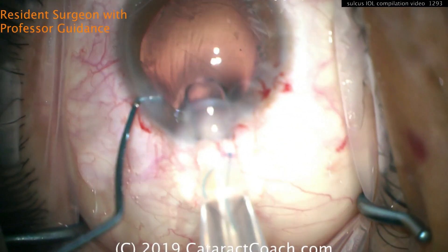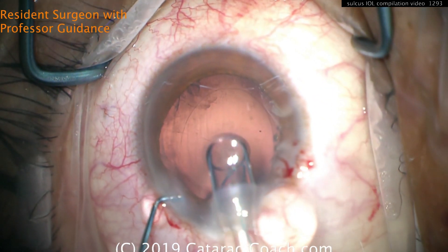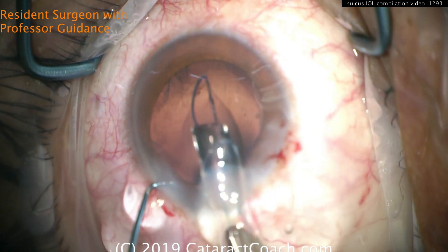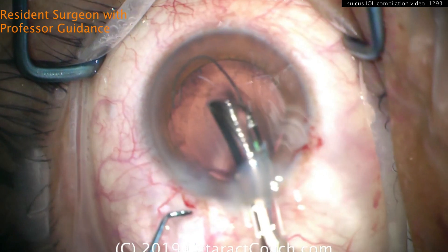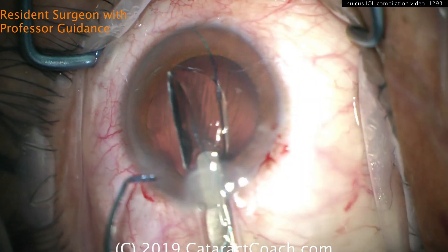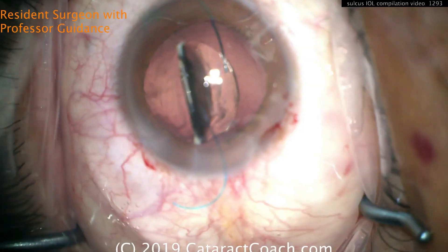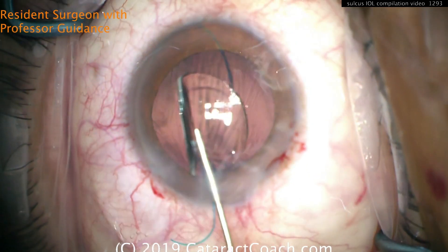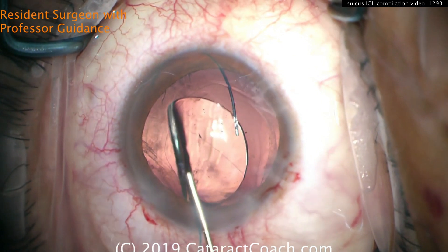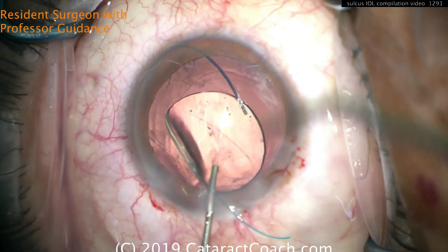A sulcus lens in the US is a three-piece lens — we don't have any sulcus-designed IOL, so we use a three-piece lens. Here comes the leading haptic, notice it goes out in the correct orientation. Let's deliver the entire IOL on top of the iris first. Haptic orientation should look like an anti-S. That leading haptic looks good; the trailing haptic needs to be flipped over a little bit.